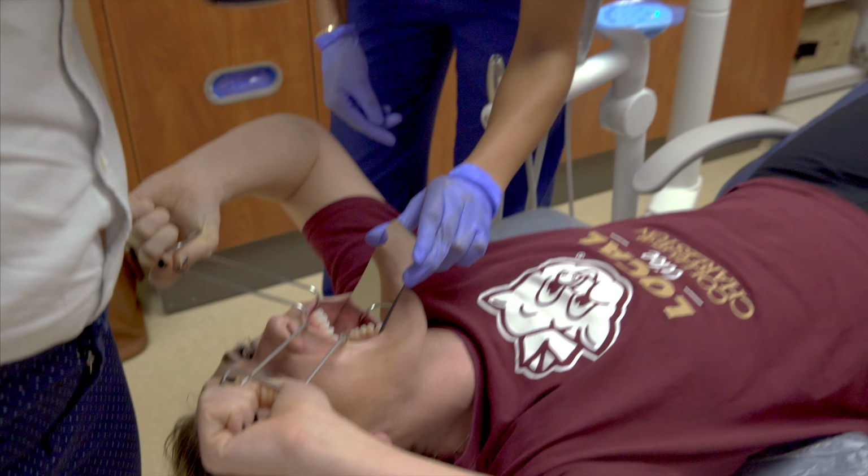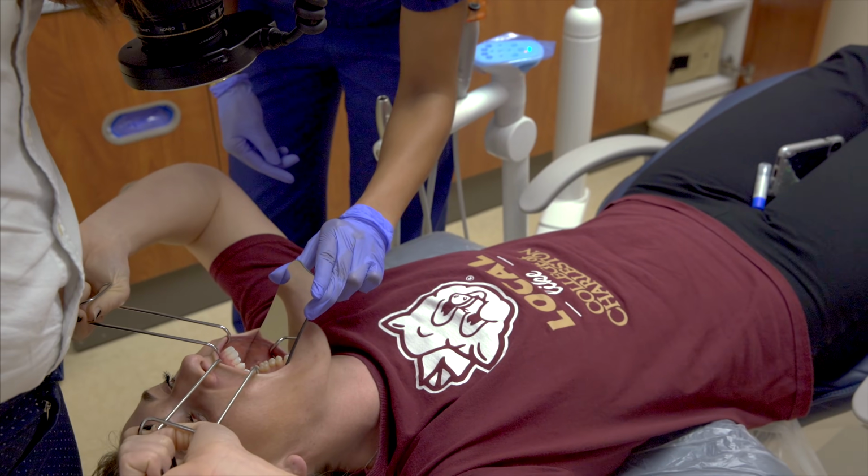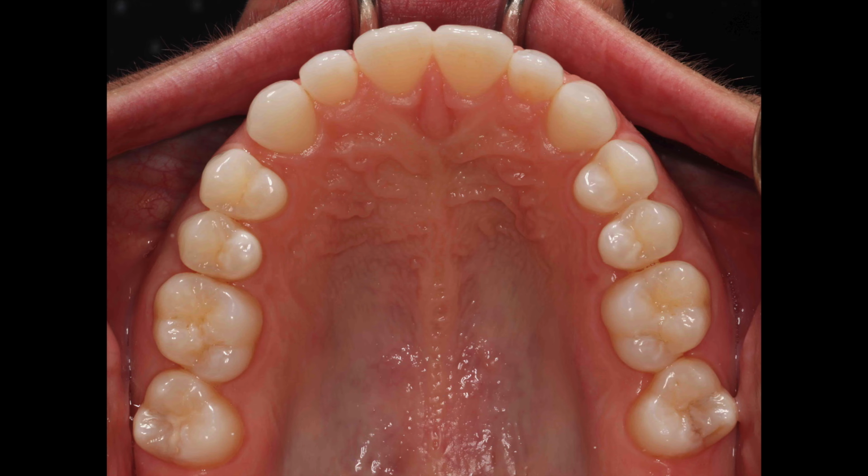How much of the surrounding tissue depends on the width of the arch and may not reflect operator conditions. The image can always be cropped afterwards. For the maxillary arch, the patient often isn't happy when you can see up the nose. You can block the nose by pulling the retractors more in that direction.